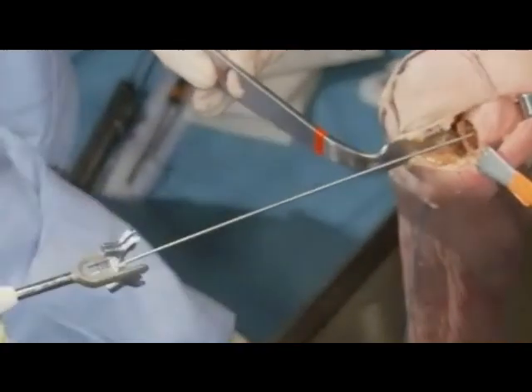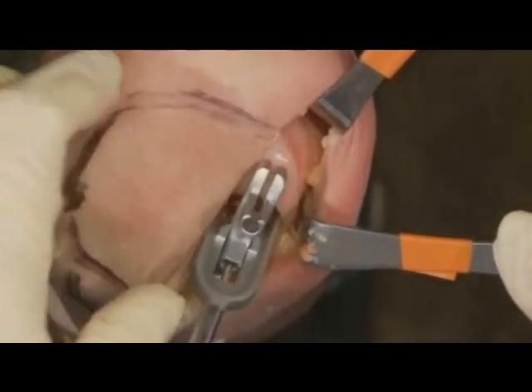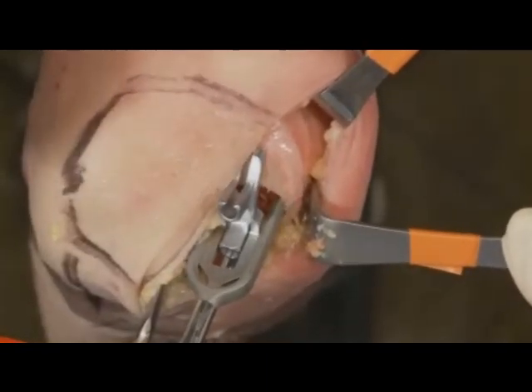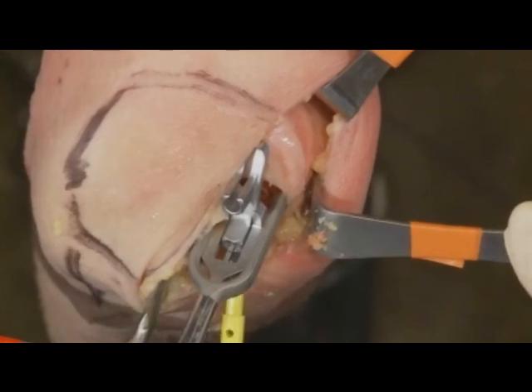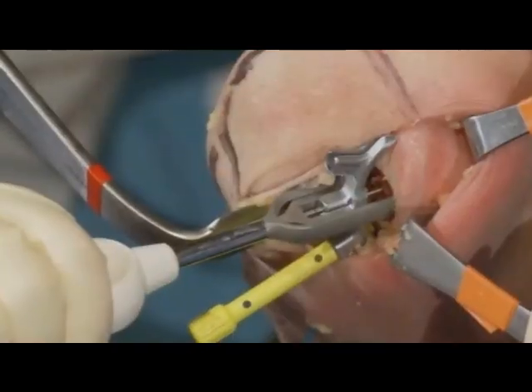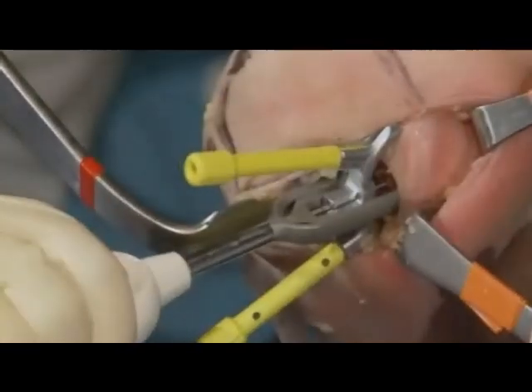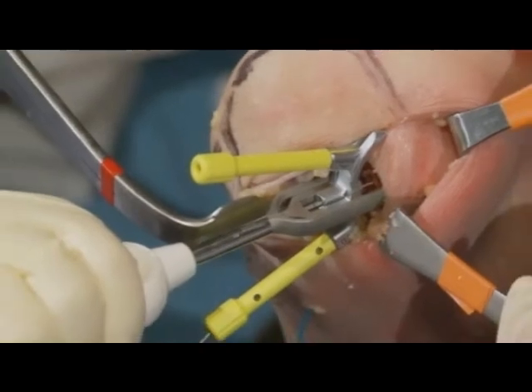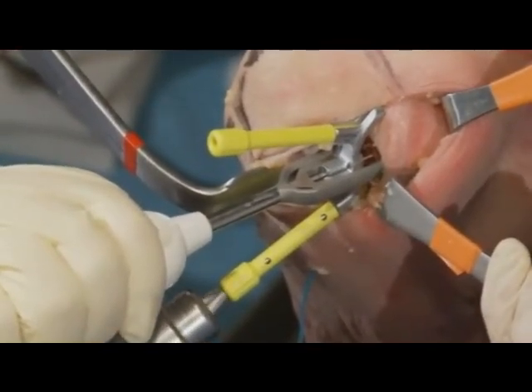Oh, sorry, let me put this. So, Steve, can you just grab that one? Yeah. So we're going to go in that position there. Make sure it's seated properly. We have these 2 pins, and these should go symmetrically around the circle. And what we're going to do is insert the bottom pin. Again, these are all cannulated and calibrated with laser marks.